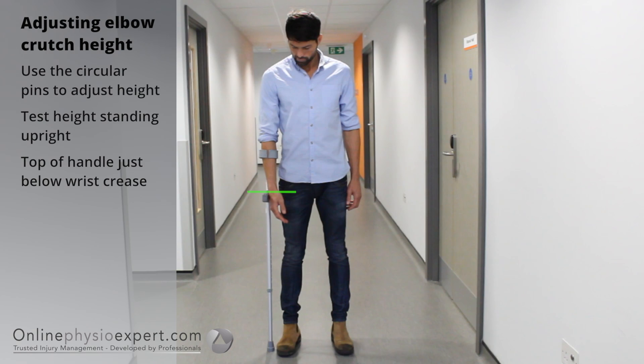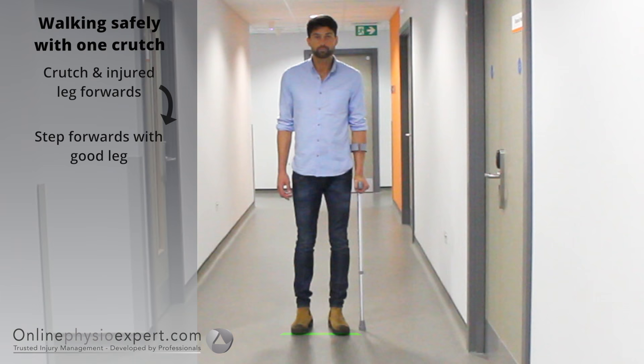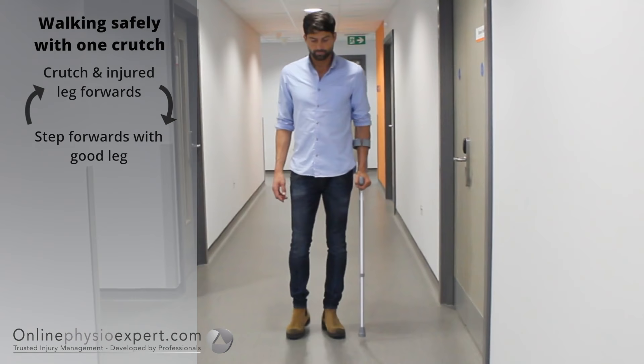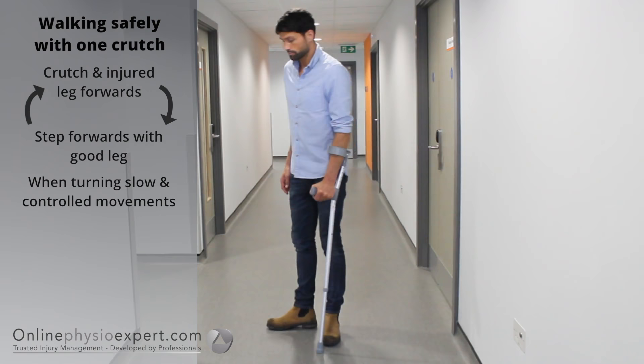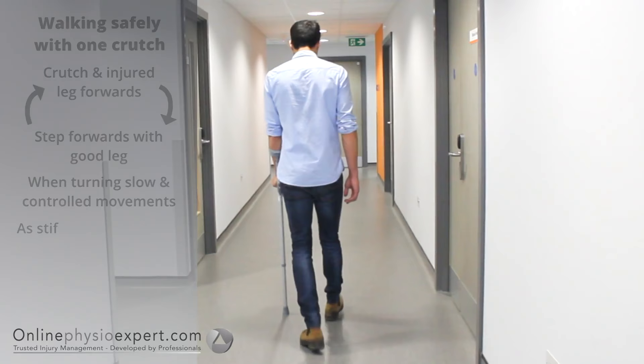Place the crutch a short distance in front with your injured leg. Step your non-injured leg forwards to lie between the crutches. When turning or manoeuvring in tight spaces ensure you step round in a controlled manner to change direction. As pain and balance allow, increase your stride length.